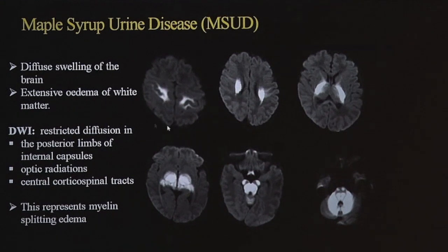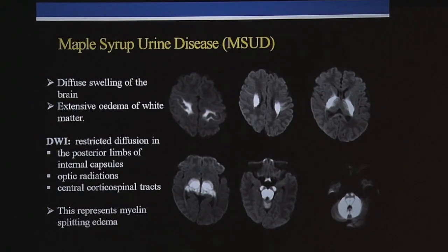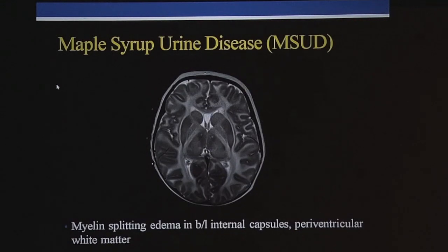Multiple siblings from the same family can present with MSUD. This edema is actually not true restriction of diffusion but myelin splitting edema, which involves the posterior limbs of the internal capsules, optic radiations, corticospinal tracts, peridentate cerebellar white matter, and middle cerebellar peduncles. Eventually, significant atrophy and degeneration of brain parenchyma occur, with periventricular hyperintensity reaching up to subcortical U fibers. Other patients show myelin splitting edema in the internal capsules and periventricular white matter, which appears chalk-like on imaging.